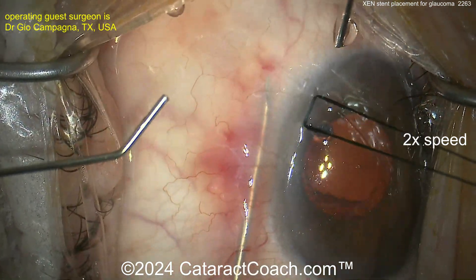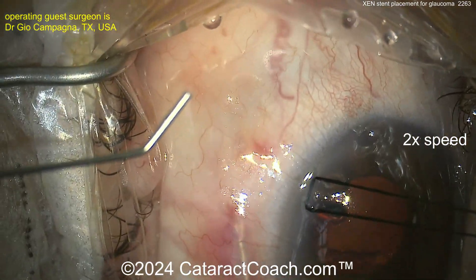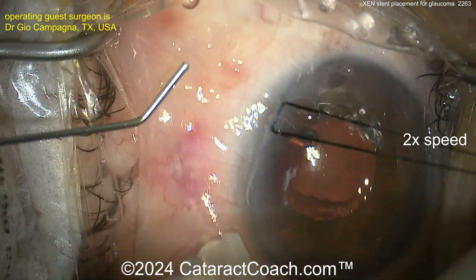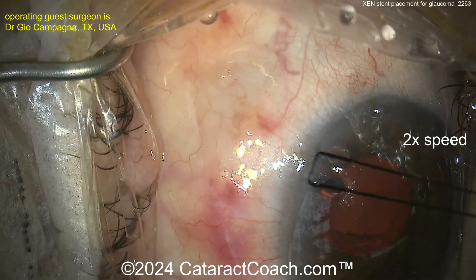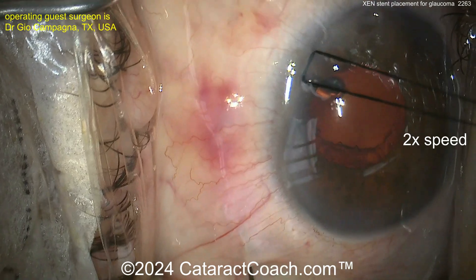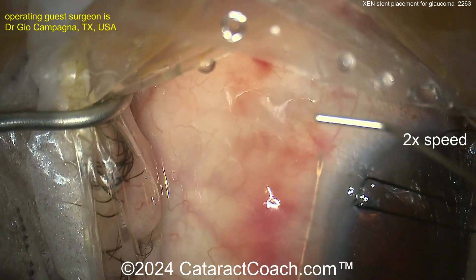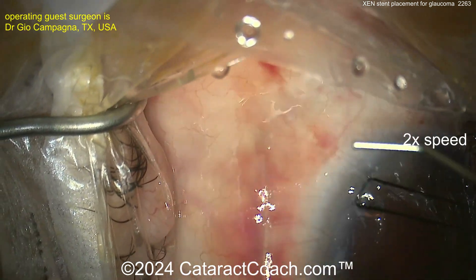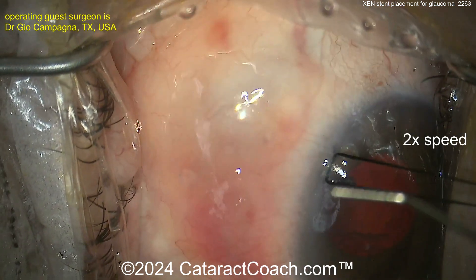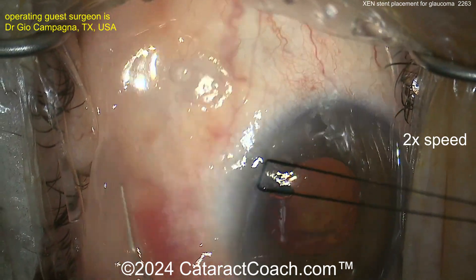This is a relatively straightforward procedure, definitely in the wheelhouse of most anterior segment surgeons. The surgical time for this case was about 10 minutes. Here's all that sweeping of the Tenon's, a little BSS, and then a small aliquot of mitomycin C spread around. Then you seal up your corneal incision, take out your traction suture, and call it a day. These patients tend to have a pretty nice effect.